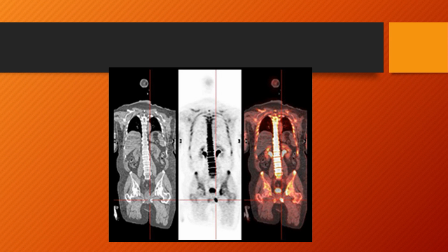There's problems with reimbursement and with availability, and without being able to prove that PET is the better test, insurance companies would still prefer to pay for the MDP study because it is cheaper. So that's been a huge hurdle for sodium fluoride bone scanning. I hope you guys do get to see it in your careers, and I hope it takes off a little bit more because it really is a great imaging tool.